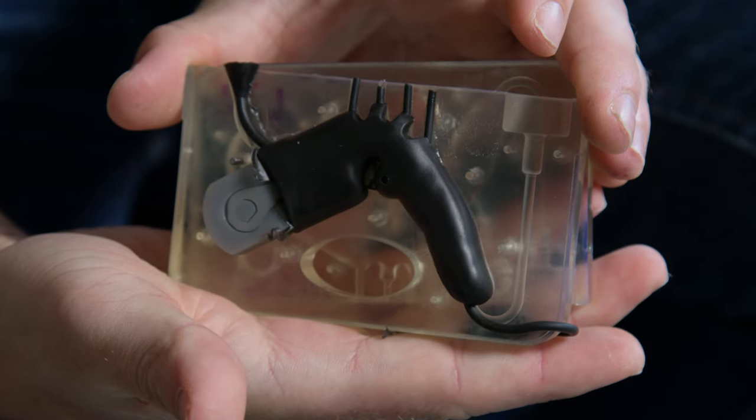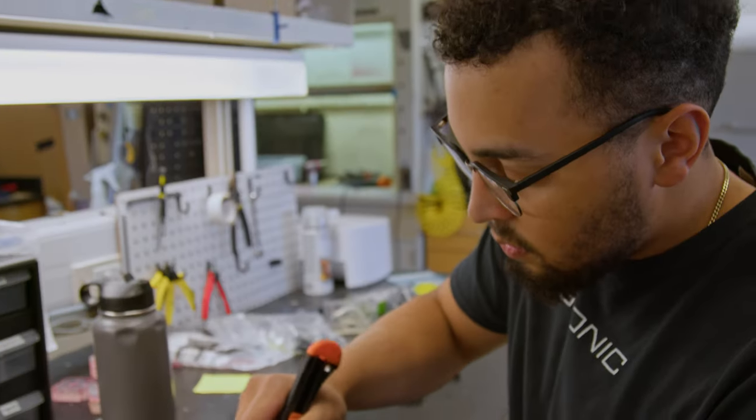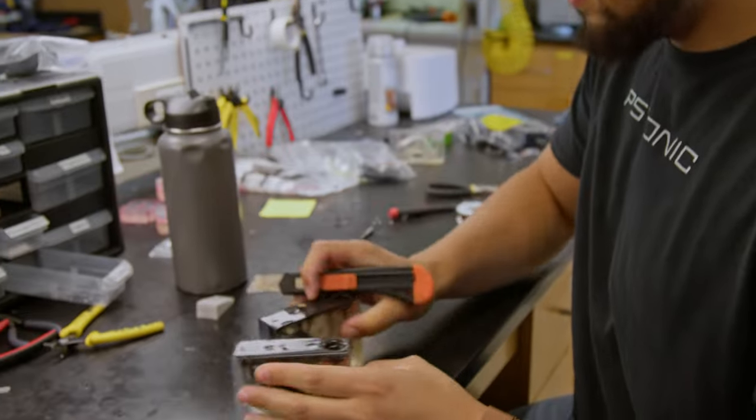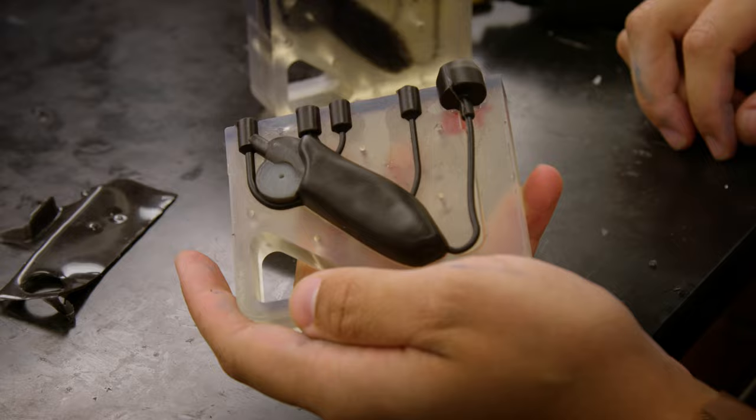We use clear resin to mold at least one silicone part, primarily the silicone fingers and silicone thumb. The surface finish needs to be as smooth as possible and we found that we get the smoothest surface finish from running it at the 25 micron resolution size.